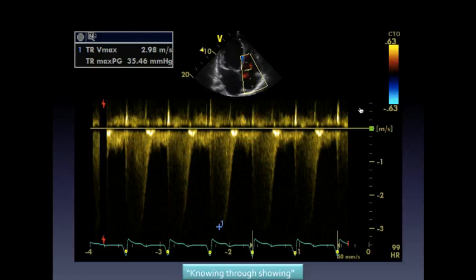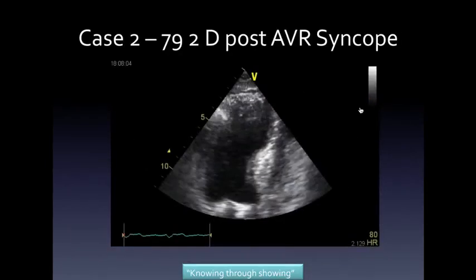Okay? The reason we underestimated is his TR jet was very minimal. He has a very competent tricuspid valve. If we had a good TR jet to work with, we might get it right. But we're going to swan him anyway because I wanted to know the cardiac output, and I cannot estimate cardiac output without a swan. And I know they're non-invasive measurements. I'm getting some bizarre looks in the audience, but this guy was swanned, and his mixed venous oxygen saturation is 42%. Okay? So he's doing okay, but there's a lot of work to do. So that is just one case that I think was relatively straightforward because we had lovely pictures, we had single system disease, there weren't many flies in the ointment, and it became relatively simple to manage.